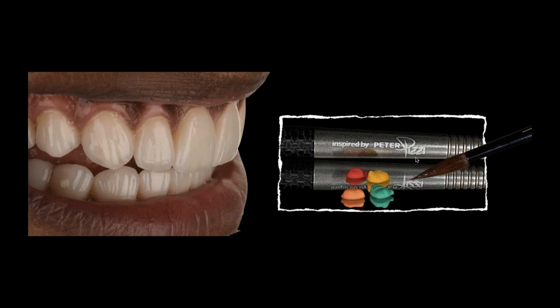because what are they really looking for? White, bright, and reflective. But when you're trying to really make it look good, that transitional point is really about the depth. And I would start very, very bright inside. I think I said in my last lecture for VITA last week or the week before, I tend to only use 2 zirconias. I use the ST, but I'm pretty much either using white or A1. Those are pretty much the only ones I really use, once in a blue moon, the darker.